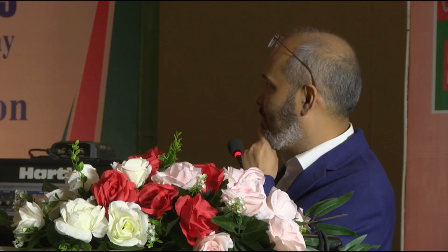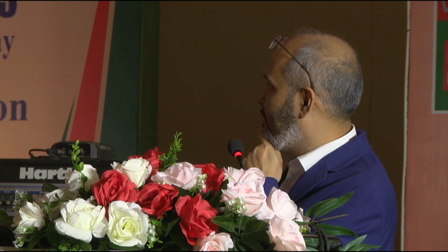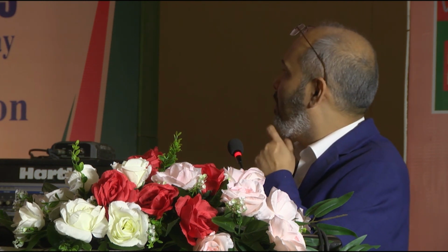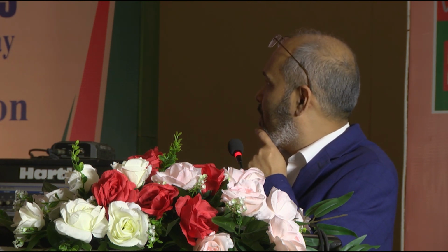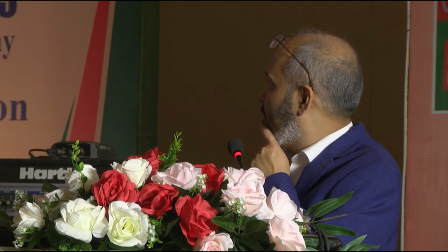Yeah, my conclusion is that you have to understand heavily calcified lesions. You have to strategize appropriately and, of course, change your strategies according to how things develop. Provisional strategy for bifurcation is a must, but bailout strategies have to be well understood. And finally, optimization of calcified lesions through imaging is of utmost importance, and that's why we still did a final OCT. As you saw, the final OCT was done, even though during the procedure we couldn't do any OCT.